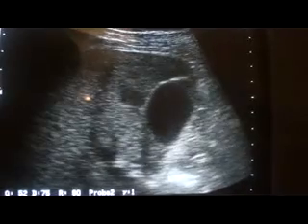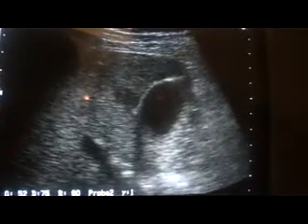That was a scan while the patient was in supine position. Now the patient is in left lateral decubitus posture, and still I can see — and you can also see — the hypoechoic area in that region adjacent to the anterior wall of the gallbladder. This is the gallbladder, and this is the fatty liver. The focal lesion under study is visible in this view as well.